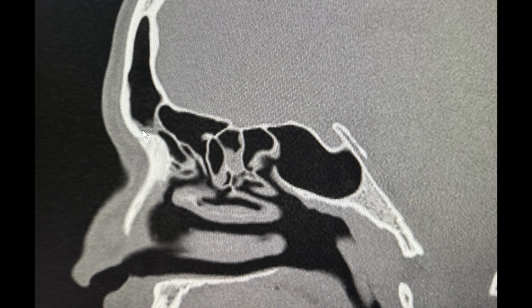This is the parasagittal section CT scan of a patient with bilateral chronic pansinusitis with essential involvement of the frontal recess, the frontal sinus, and patchy involvement of the ethmoids. The presenting symptoms are recurrent headaches, which get exacerbated on air travel, as well as sometimes normally, with recurrent episodes of nasal congestion and nasal obstruction.